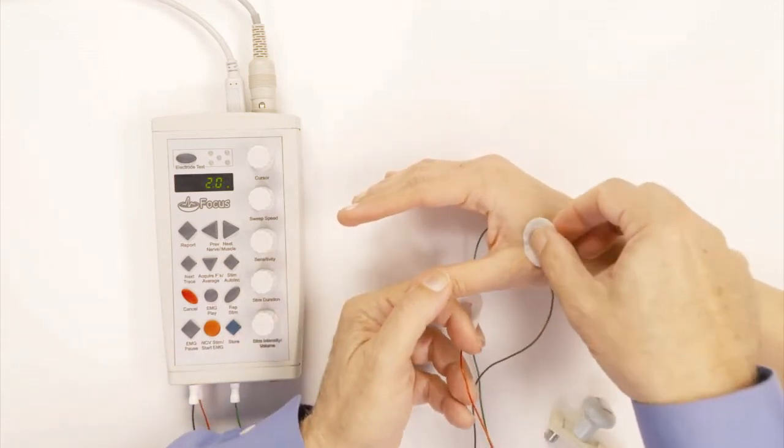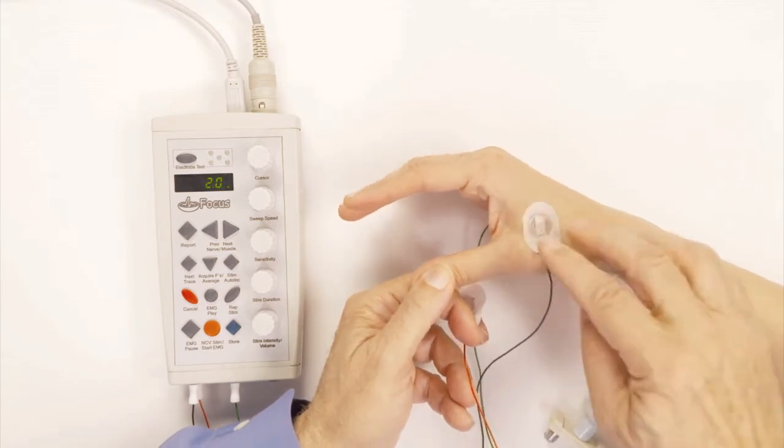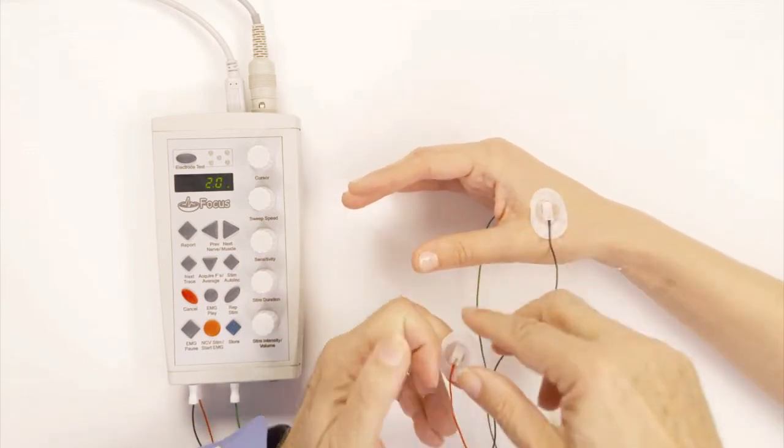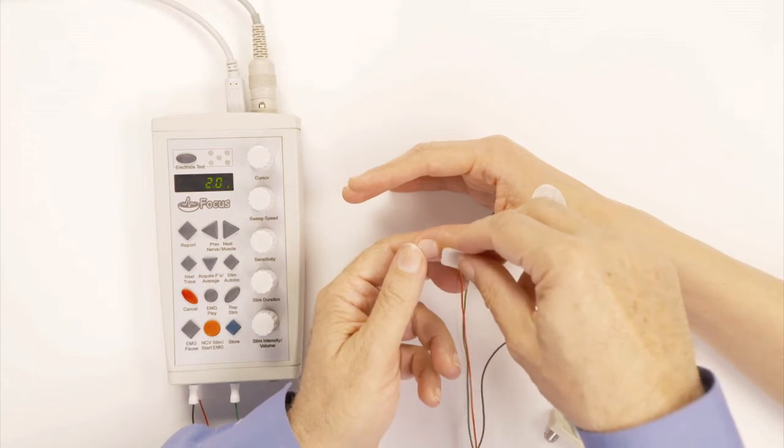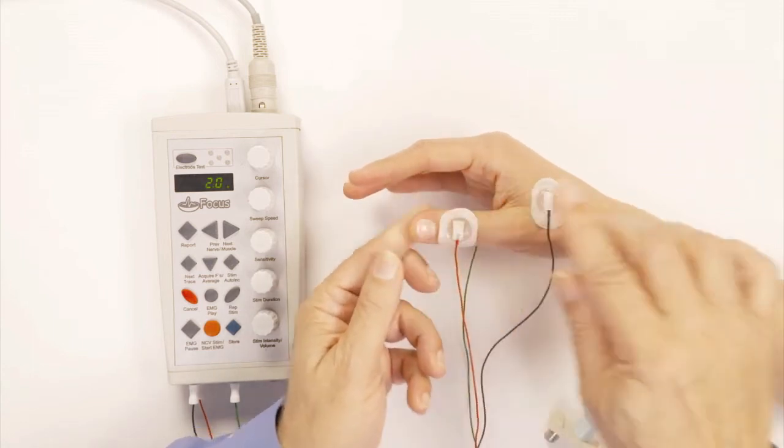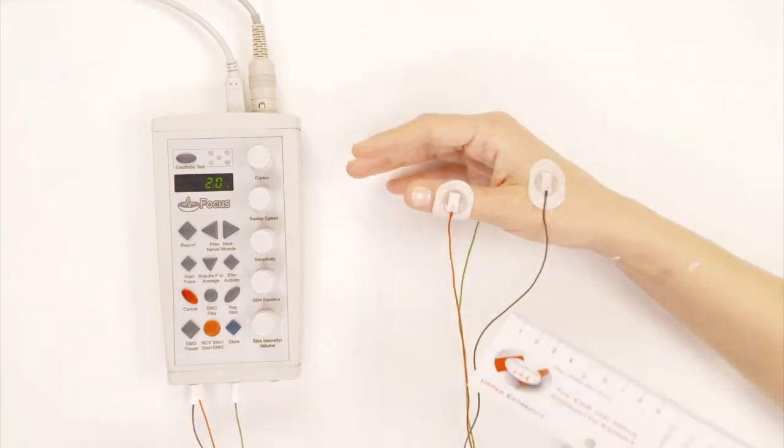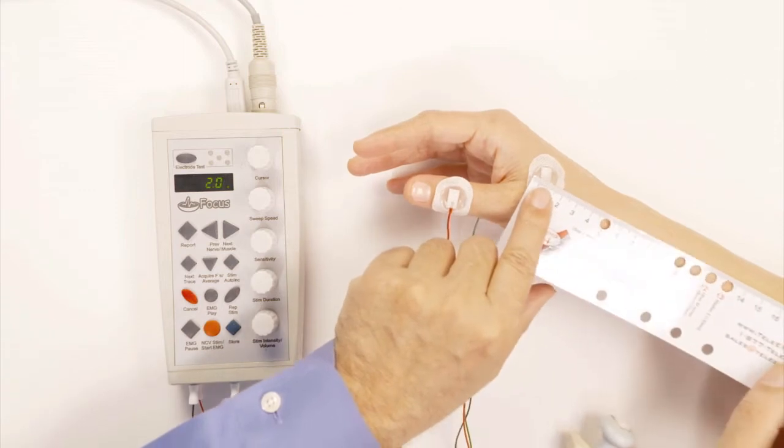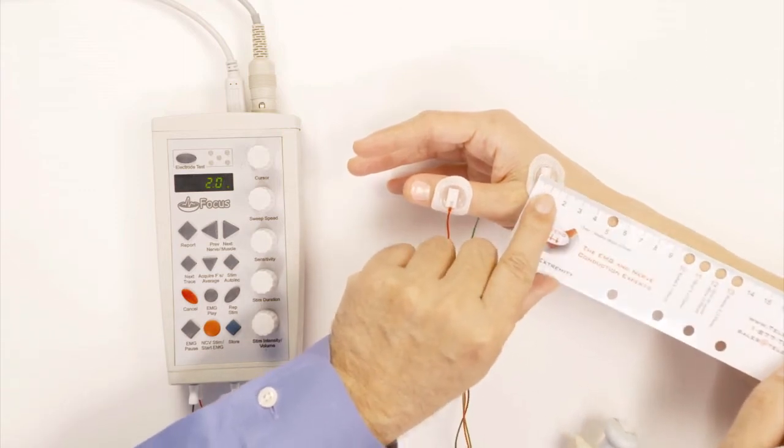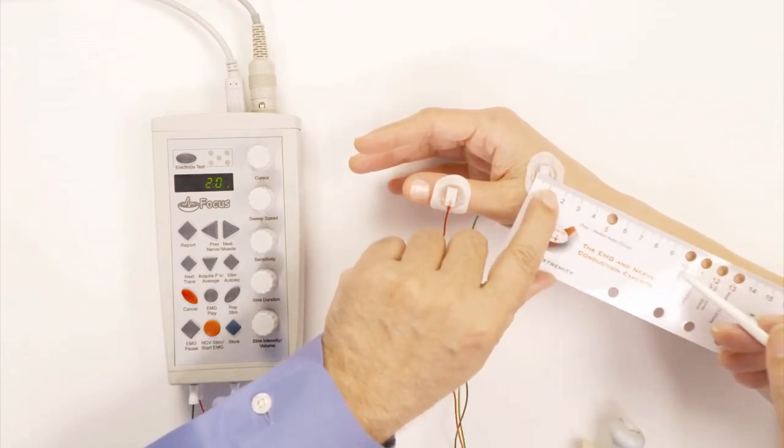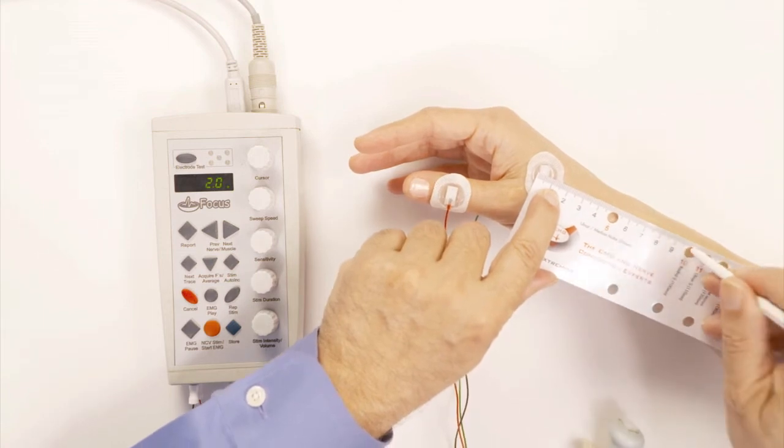Again, this is between the thumb and index fingers, and I will put the reference electrode here. Now I take the ruler to measure for the radial sensory, and I put it right here. You will see where it says radial sensory, that's the 10 right here.